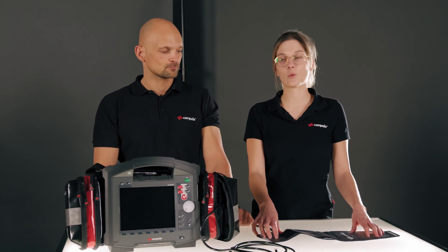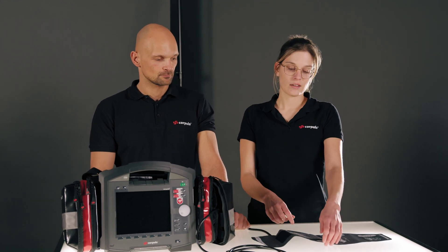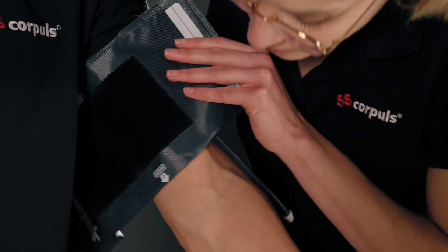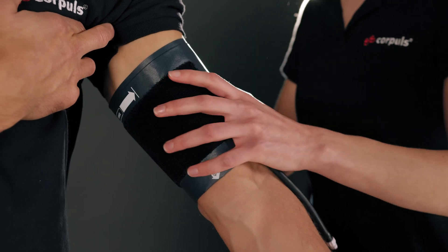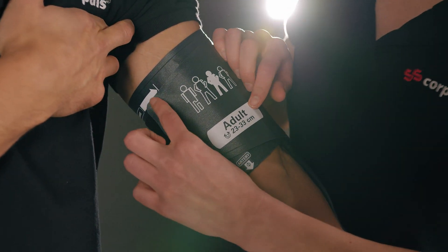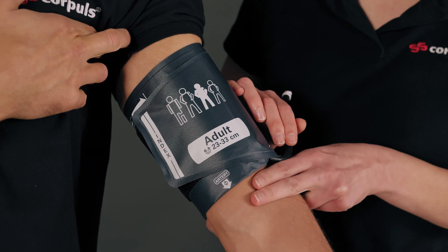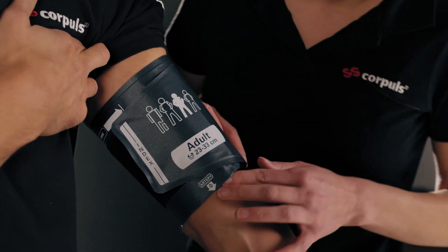After creating the right conditions and explaining to the patient what we are about to do, we select the correct cuff size. Here it is really helpful to take advantage of the range index. I simply take a cuff, correctly place it on the patient's bare arm, and close it. What we see here is that the white index stripe is within the range indicated by the arrows above. I also have a distance of about two centimeters to the elbow and the artery — if I were to feel it now, it would be here.